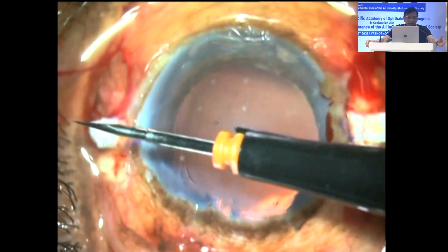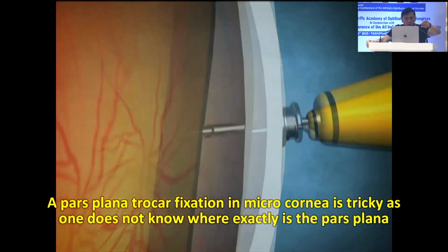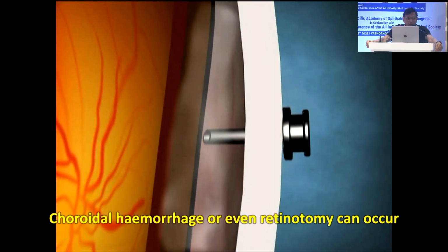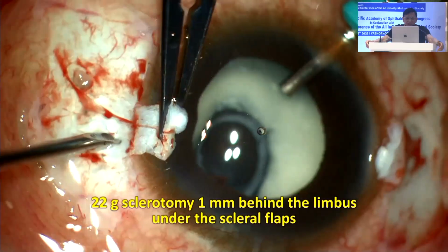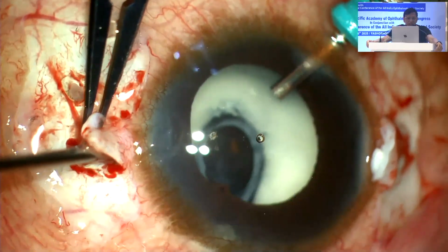If you use an AC maintainer, yes, but again you make an incision, then you push it inside, and you do not know if it's too large or too small. If you put a pars plana, you can go into a choroidal detachment, you can get a bleed, choroidal hemorrhage, retinotomy, anything can happen. Now once you have done that, now I'm making my sclerotomies.